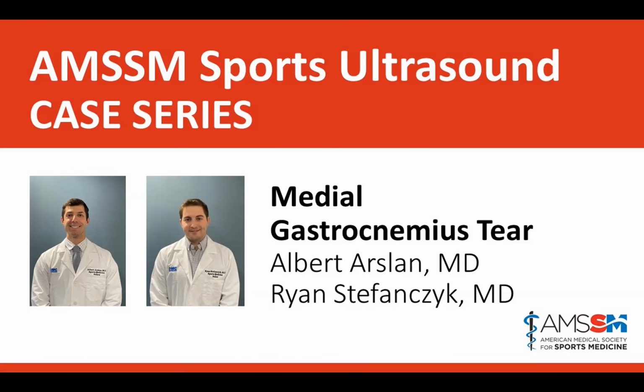The identification of the plantaris is important here because that's going to sit right in that same tissue plane between the gastroc and soleus. And so sometimes these plantaris ruptures, like you showed one example, can somewhat fool you into thinking you're seeing a gastroc tear. So just identifying that, which you guys did, I think was brilliant and was perfect.